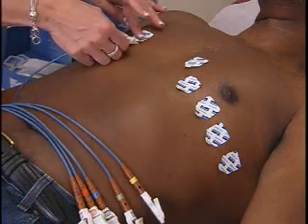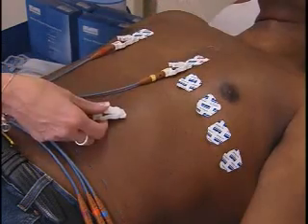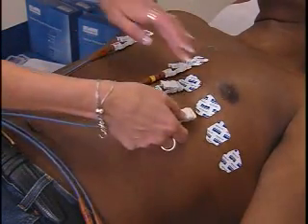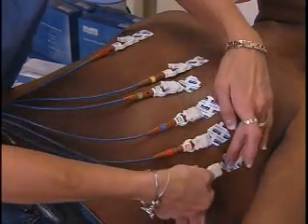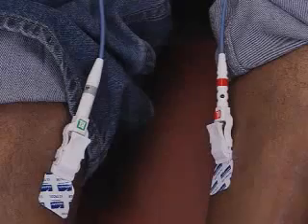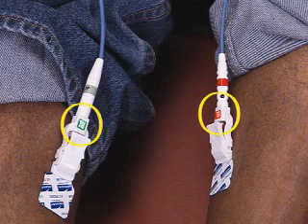V1, red, brown. V2, yellow, brown. V3, green, brown. V4, blue, brown. V5, orange, brown. V6, purple, brown. Remember that the right and left designators on the patient cable are referring to the patient's right and left.